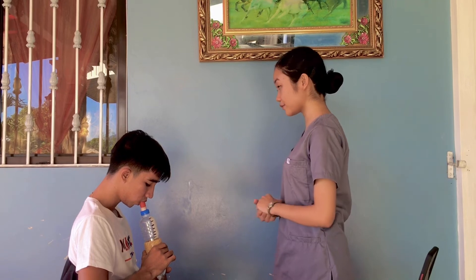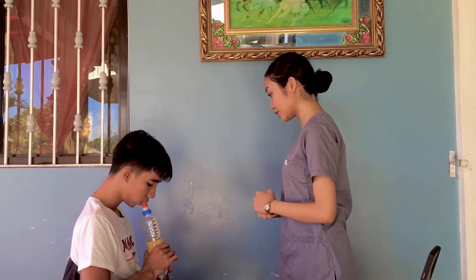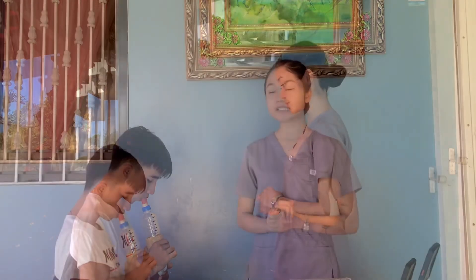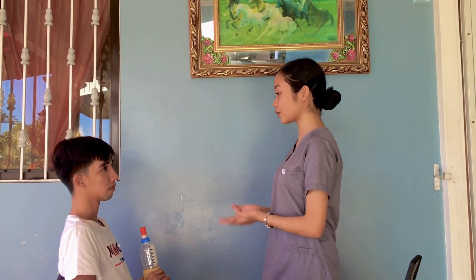Once it reaches the bottom, exhale completely and then repeat the steps for 10 times. After 10 sets, advise the client to cough, because coughing will help clear secretions. Sir, can you cough? Okay, thank you. Repeat these steps every hour.